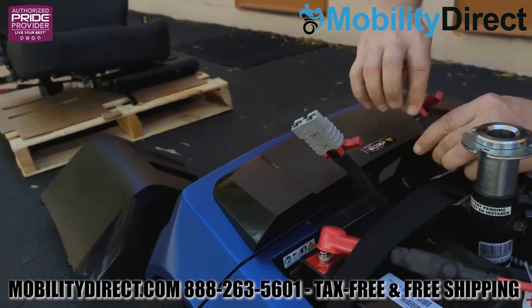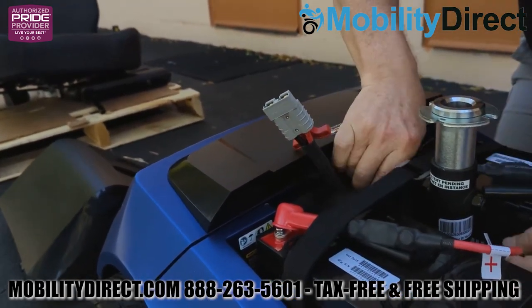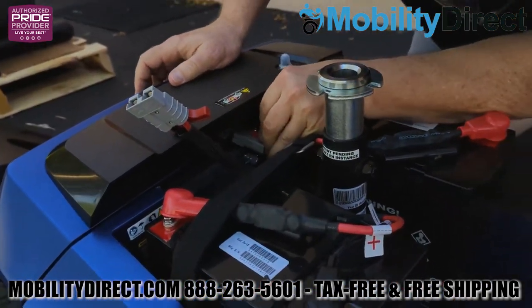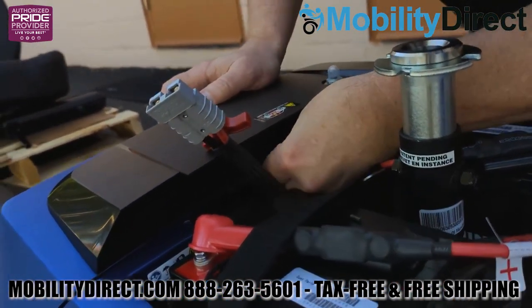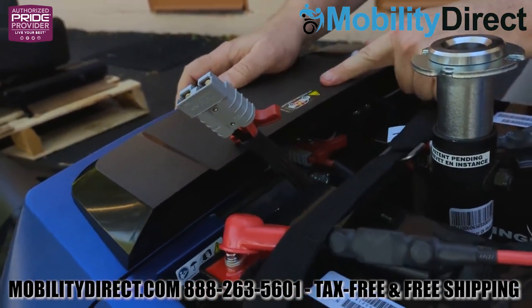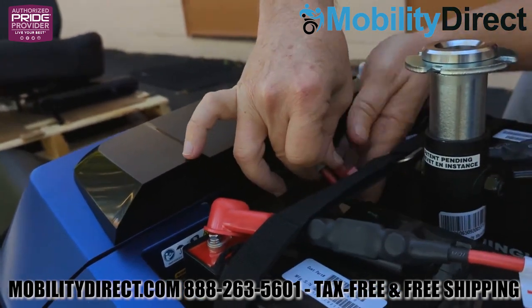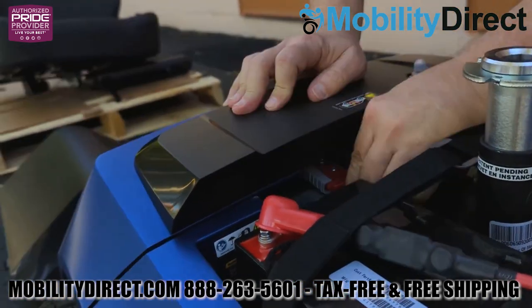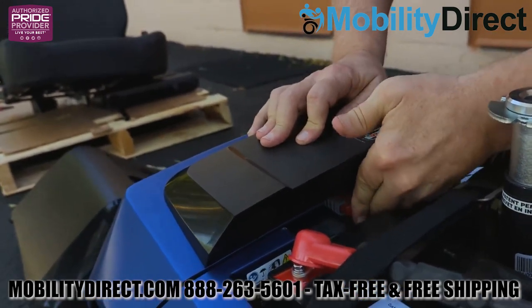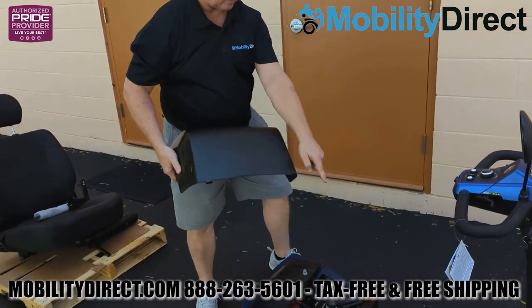It's a little bit difficult to see the actual connection points, but if you look under that black body piece in the back of the scooter where the stickers are, you're going to see two terminal connections. Go ahead and connect those two power connectors into those receivers. You need to install both of those harness connectors because this is a 24 volt system, and each battery is going to deliver 12 volts to the unit. Go ahead and firmly connect them as shown here.